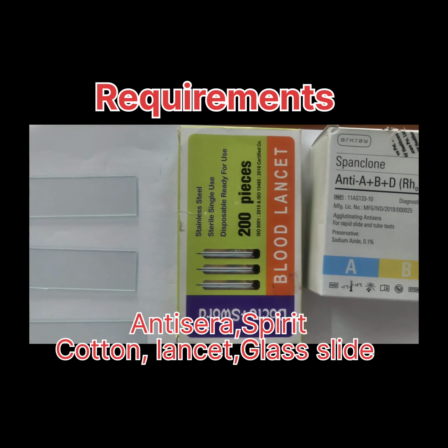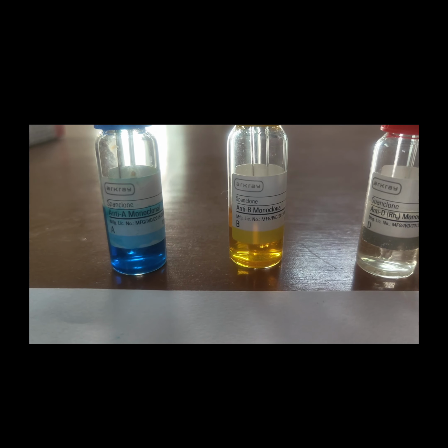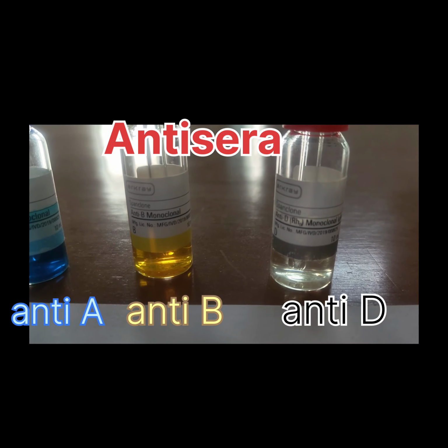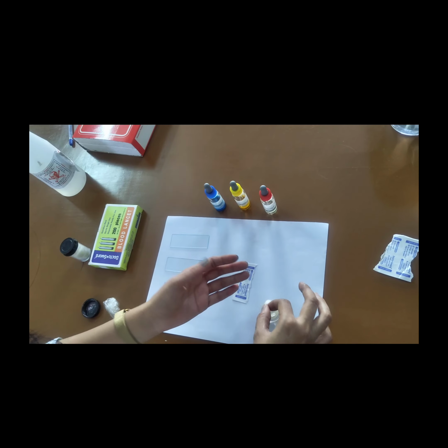For this practical, we require antisera, spirit, cotton, lancet and glass slide. These are antisera. Blue one is for anti-A, yellow one is anti-B and transparent is anti-D.